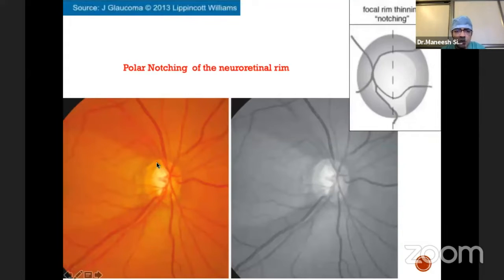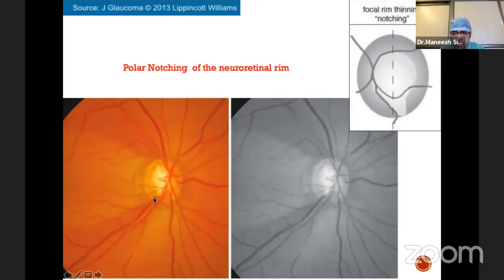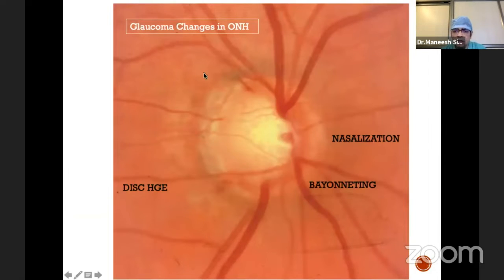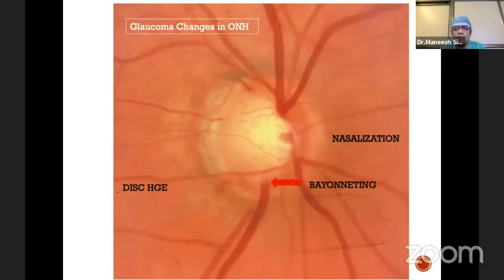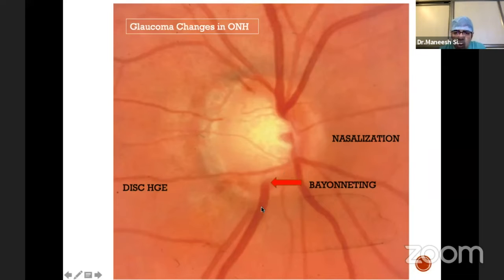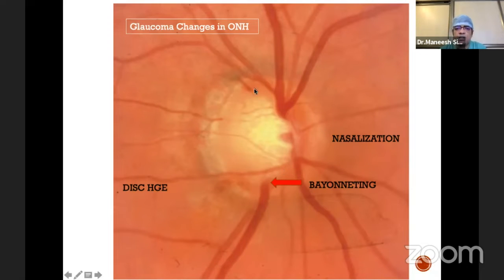In this patient you can see polar notching — the superior and inferior neuroretinal rim has become thin. There are certain common findings we see in the optic disc which we should be aware of. For example, the bayoneting sign, which is a sharp 90-degree turning of the optic vessels when the cup increases in size. In this case, you can see the neuroretinal rim has become thin.